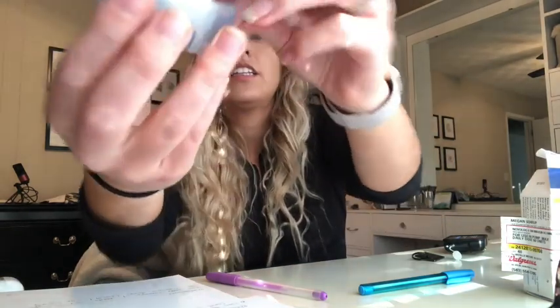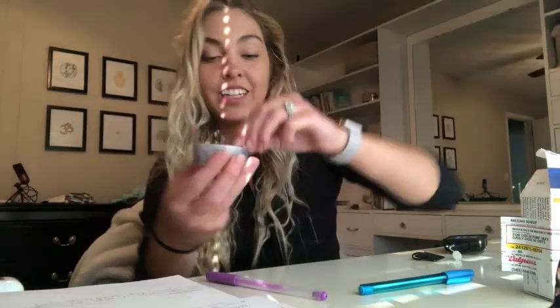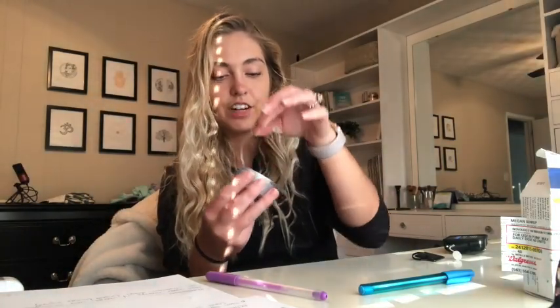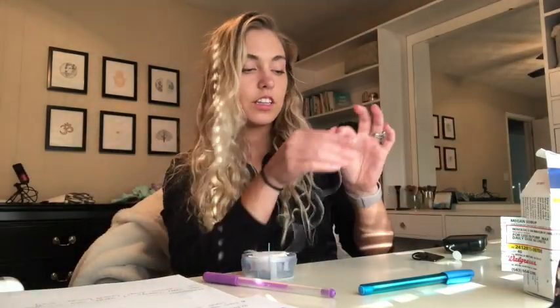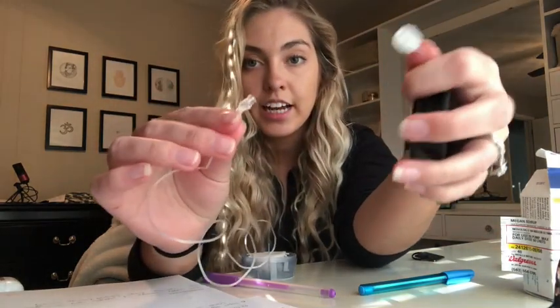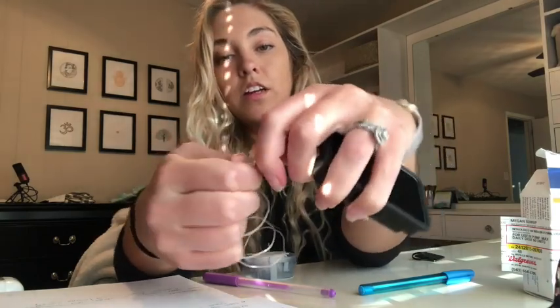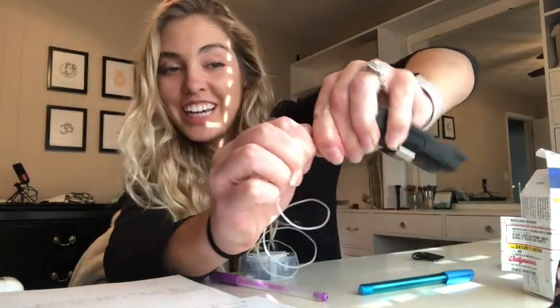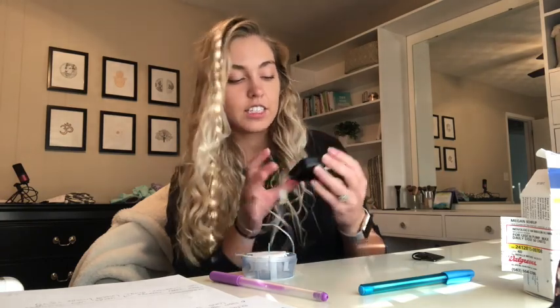So then this is kind of hooked, so you want to unhook it, but gently, because this thing is very fragile. And then you just start to unwrap your tubing all the way. And then I'm going to take this end of the tubing and connect it with the end on the pump and twist it extra tight. Wonderful. Okay, so then I'm going to hit okay that it's connected.